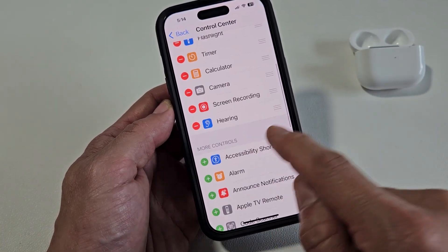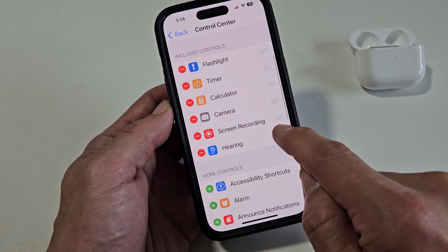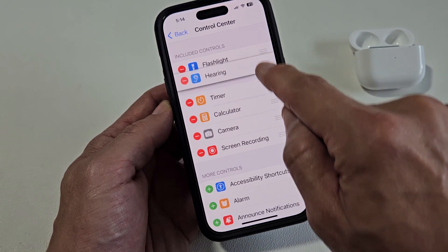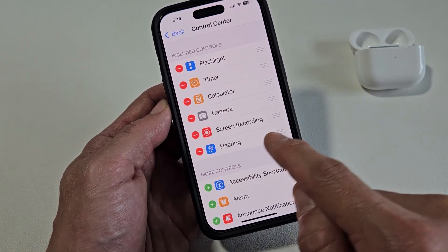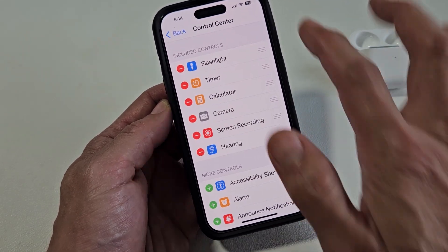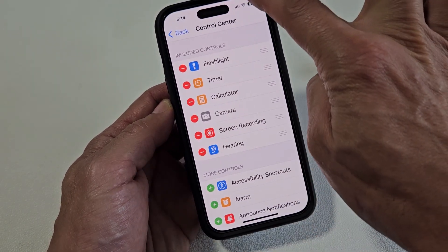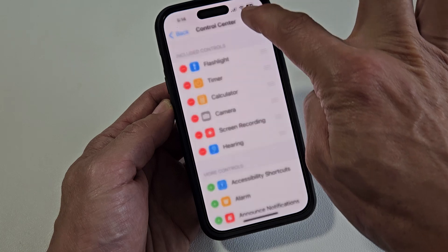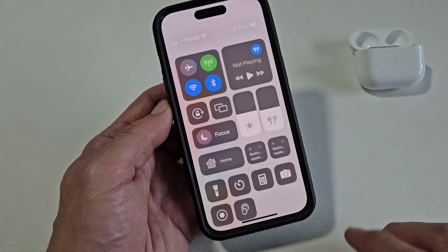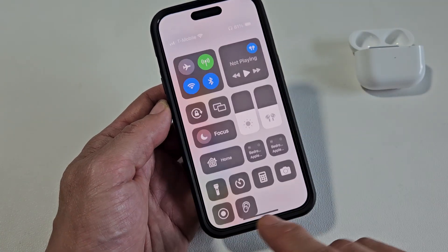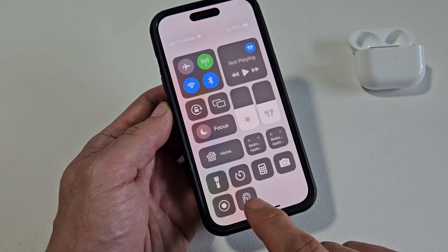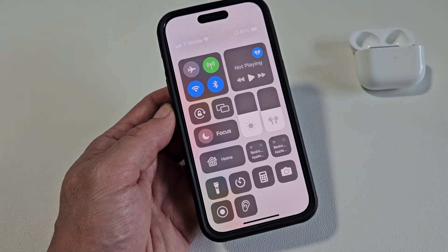Now Hearing is over here, and I can move this into a different area as well. But if I leave it down here, just like that, and on the top right-hand side I'll slide down, go to my Control Center, and it will show up as the last one here. Pretty simple.